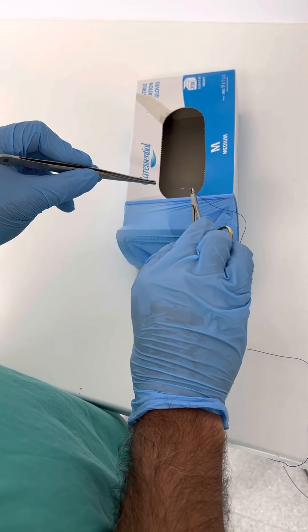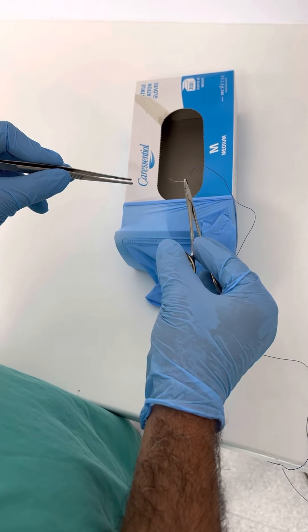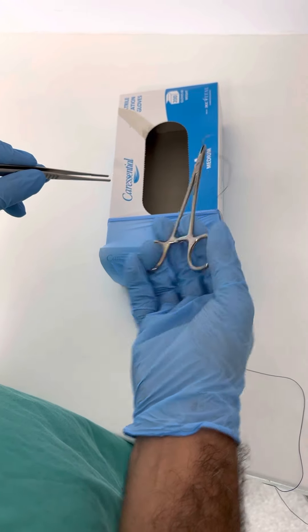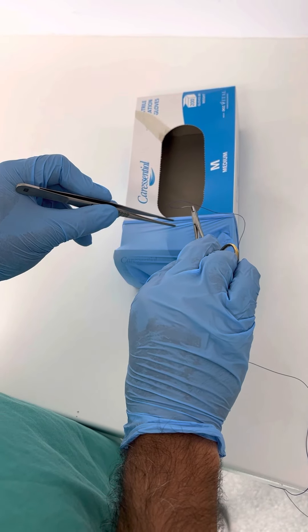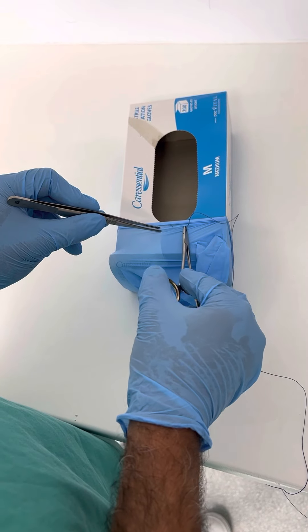If you want to go thicker, you just need to go almost a right angle. The way you make a right angle is by pronating your hand — that's supination, and that's pronation. So there it is. I'm going to take my first bite, and then I come out.